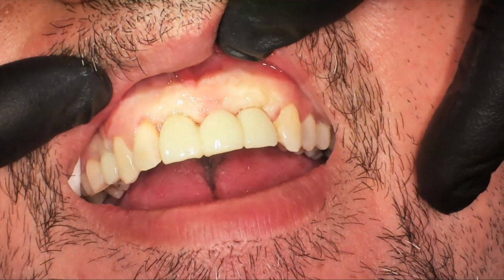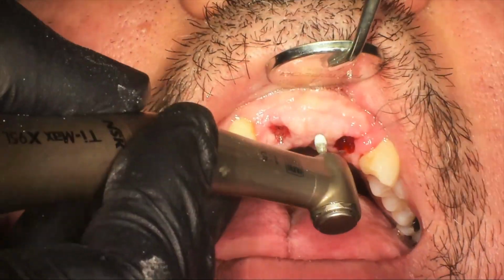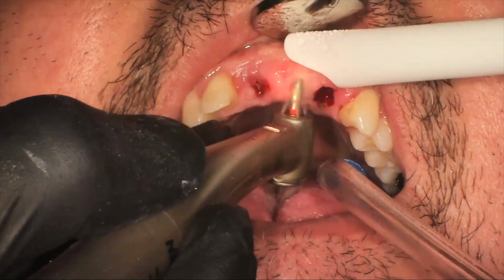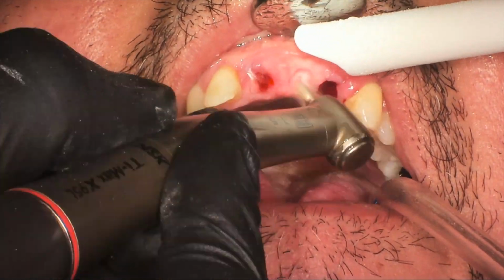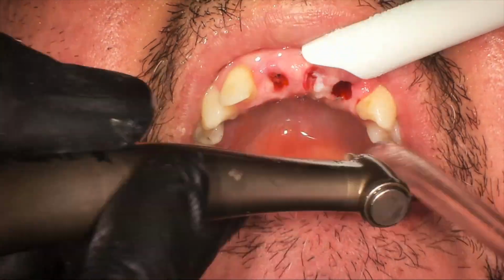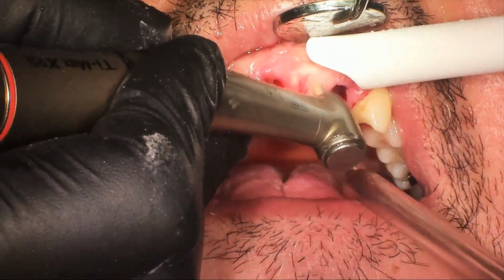And now we're going to unscrew this, take this out, get an idea of what we want tooth number 9 to look like gingivally. We've given our patient anesthetic, and here we're going to use a football diamond, and we're essentially just going to create an ovate Pontic site and kind of trace out our gingival margin. So again, right here, tracing out our ovate Pontic site, building it the way we want it to be so we can get our restoration seated and get a tooth that looks like it's coming out of the gum.